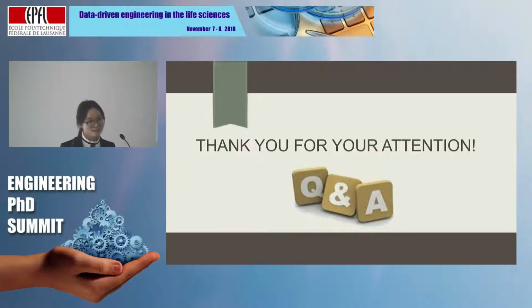Considering the navigation capability, did you do any comparisons with the state of the art based on imaging, like fluoroscopy, or sensors placed on the robotic manipulator? Yeah, the robot is integrated with sensors, position and force sensors. And we haven't compared to imaging sensors, because the information from the sensors we integrate is already adequate for our planning.